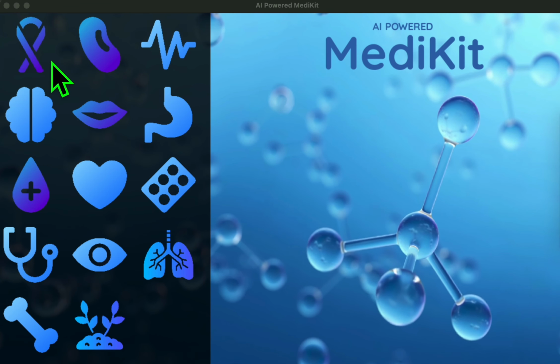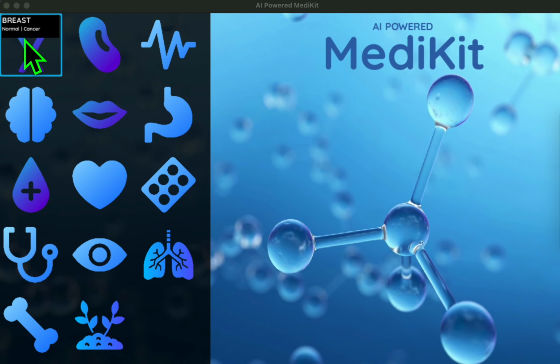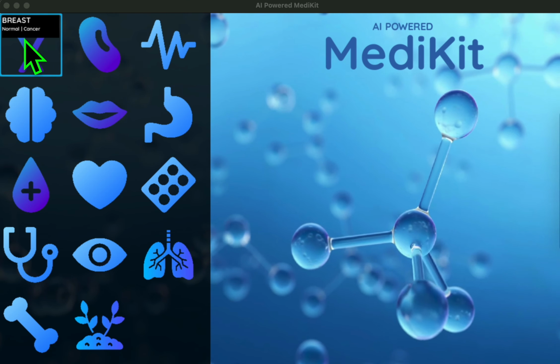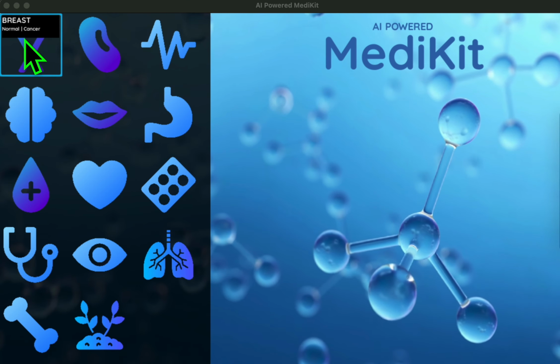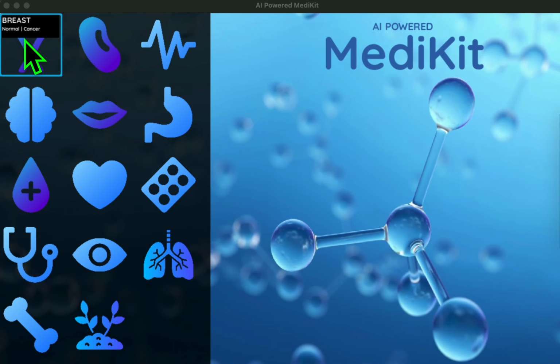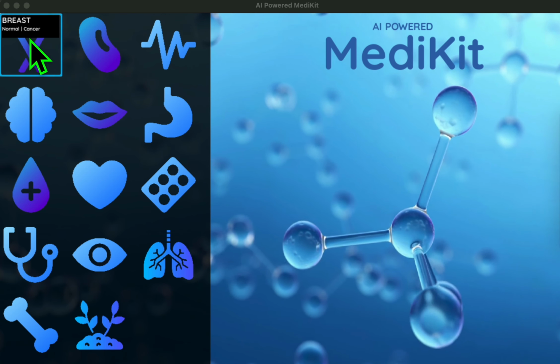And the classification we have followed here, as I have said, is not a normal classification. It is a ViT model based classification. We have a vision transformer that performs self-attention on each patch of the images for this classification. So it's not a normal classification, which may not work on these complex patterns. These patterns are actually not complex but very subtle.